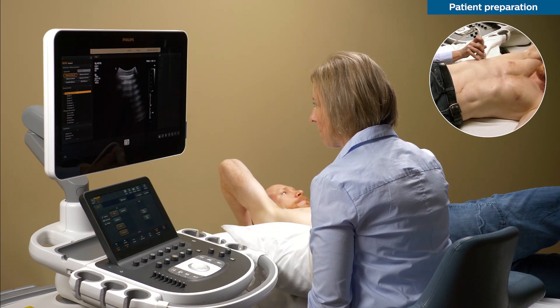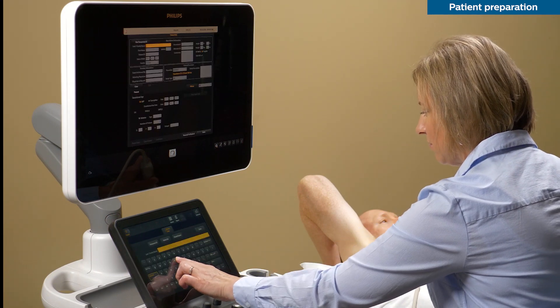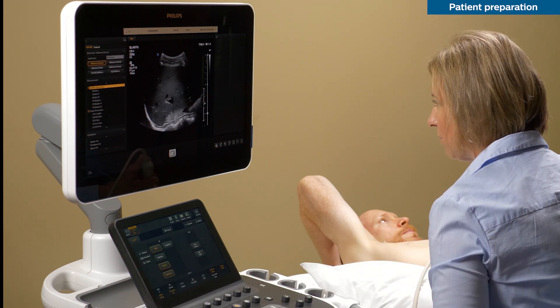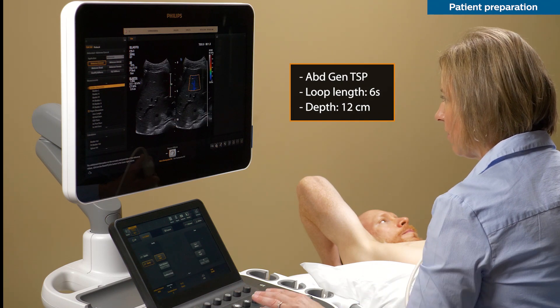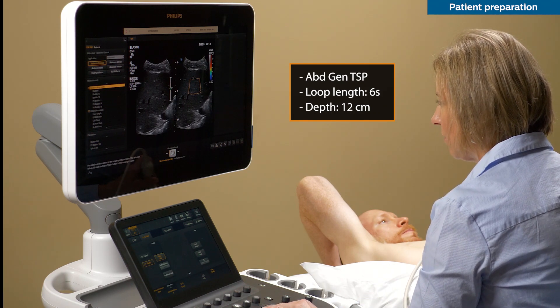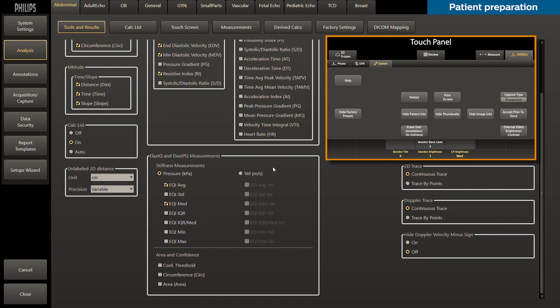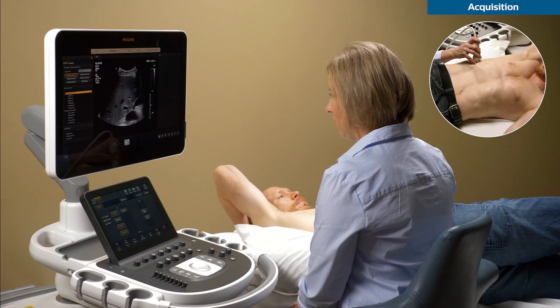Once your patient is in an optimal position, you can proceed and enter the patient name, select the C51 transducer, and the customized ALASQ preset. This will include abdomen gen preset settings, a six-second cine loop, and 12 centimeters of depth. Before starting your exam, you always have the option to choose the units of your measurements. Within setup, you can select meters per second or kilopascals as default on all of your exams.